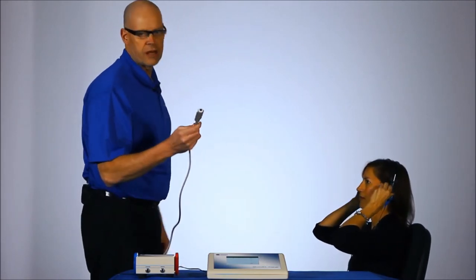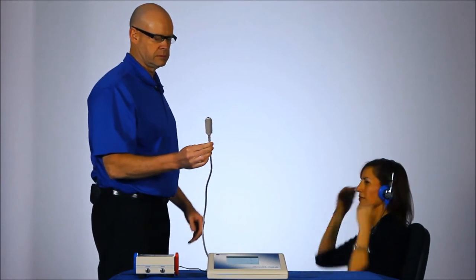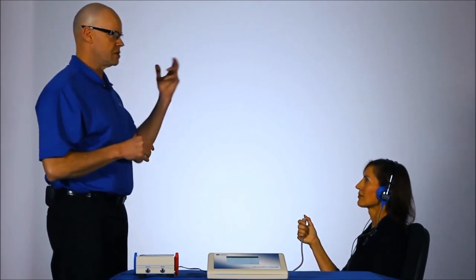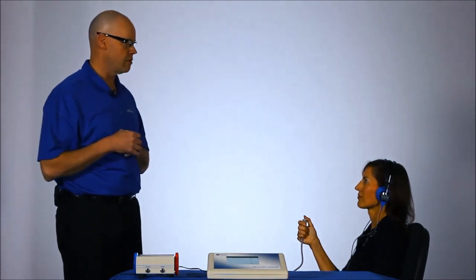And then the standard patient response button. We'll get Delia to hang on to that. We always explain the test to the person in simple terms. You're going to hear a series of beeps. Some of them will be very high-pitched, some will be low. Some will be soft, some will be loud. Whenever you think you hear them, push and release the button. For this test, we're using pulse tone. So you'll hear three beeps in a row at any of those points.